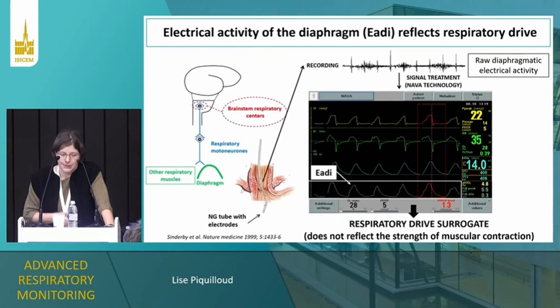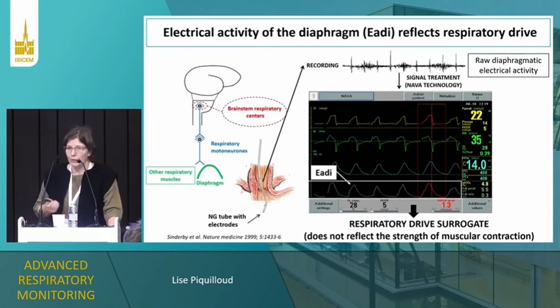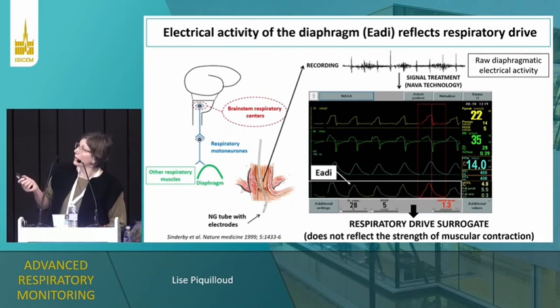First, this is the electrical activity of the diaphragm monitoring, for those who maybe have this technique. And that's exactly what I've just explained. The signal is coming from here, travels up to the diaphragm. There is a depolarization here, recorded by electrodes.